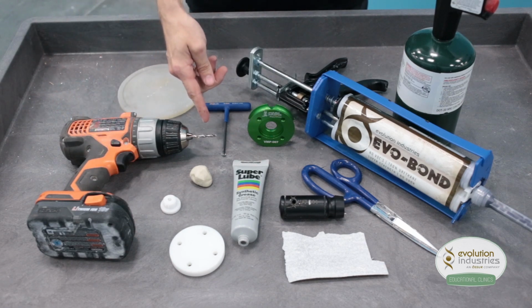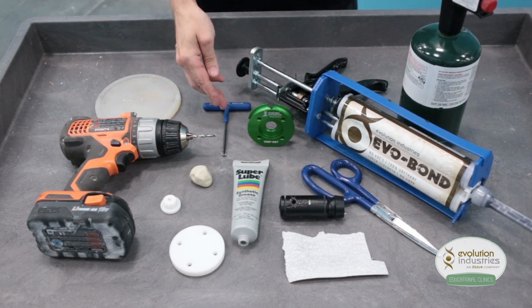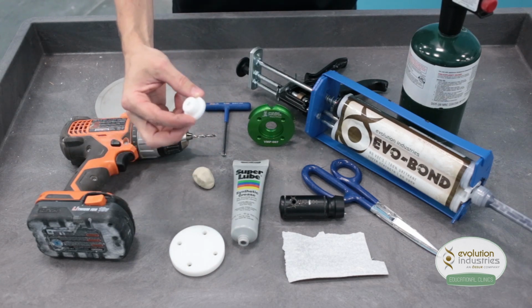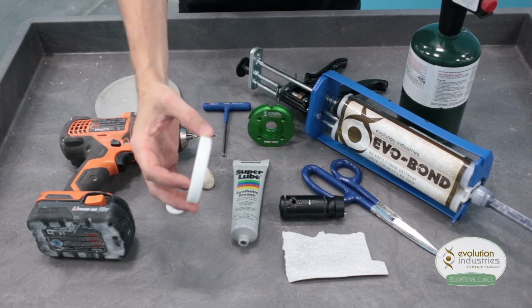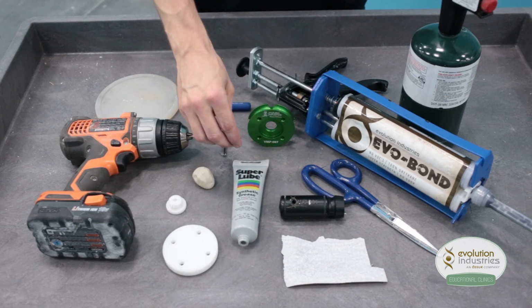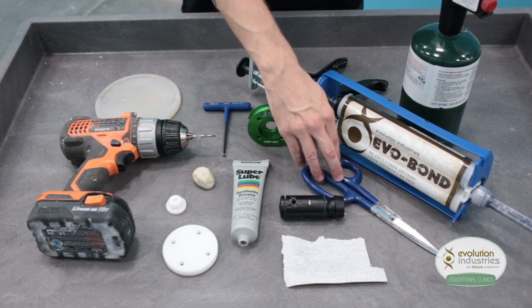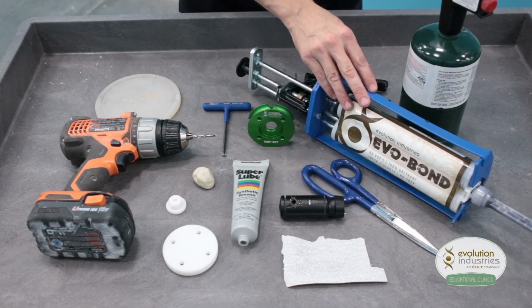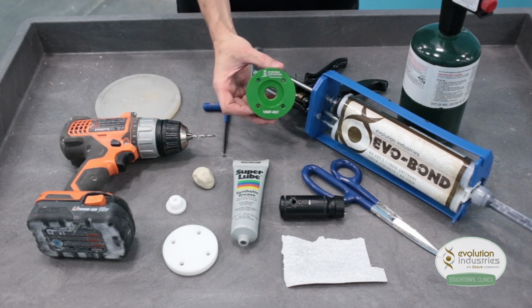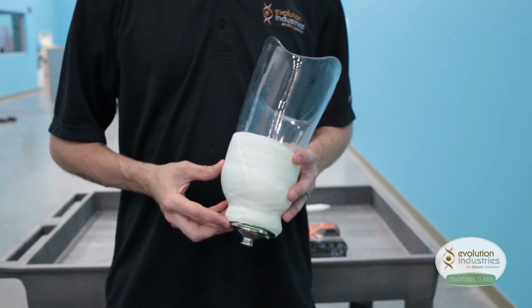A drill with a 1/8 inch drill bit, a torch and silicone pad, 4mm wrench, plumber's putty, a valve housing dummy, a lamination plate or puck, synthetic grease, 60 to 80 grit sandpaper, our WT001 wrench tool, sharps shears, our Evo bond available here at Evolution, and our VMP007 valve plate.